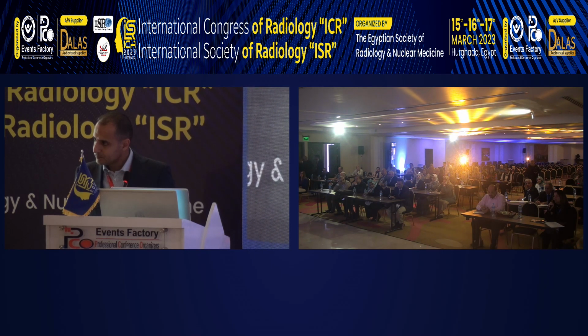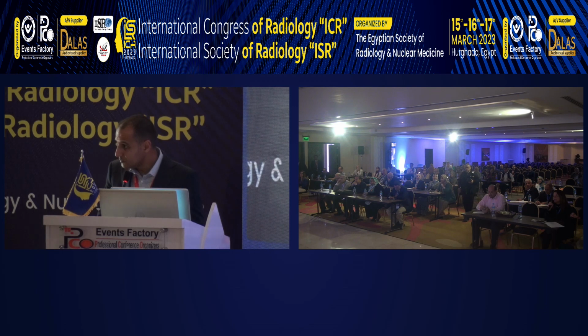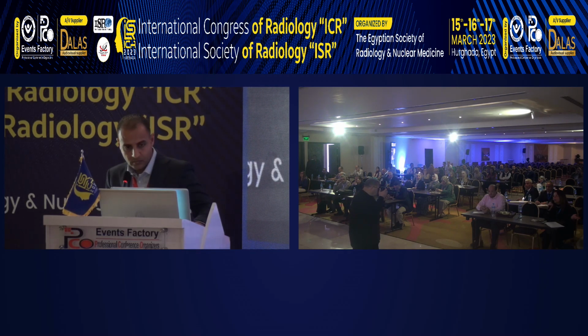Thank you for the good presentation. I want to ask you about your protocol in adhesive capsulitis or frozen shoulder. Do you start with contrast? Does your protocol routinely include contrast? Because as we know, most of these patients are of older age, with renal impairment and gadolinium concerns. Some of the patients do not prefer contrast. So what do you do about that?